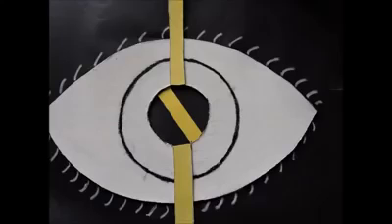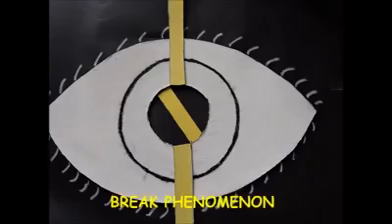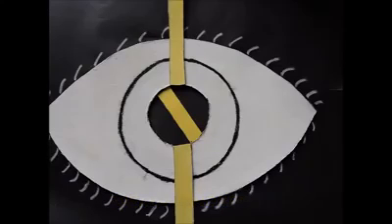This procedure, that is retinoscopy, gives us the gross value of the refractive error of the patient's eye. To get the net value, we deduct the working lens from the gross value. For an astigmatic eye, we can determine and refine the axis using the break phenomenon. When we keep the streak at 90, the pupillary reflex sometimes is seen obliquely, that is, the axis is present. The procedure is to align the streak along with the pupillary reflex.